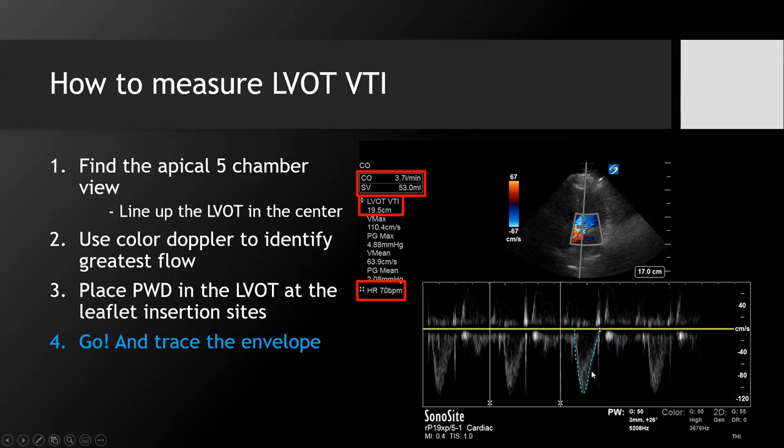You want to get something. This is borderline already. Even this example that I'm giving you is not the most perfectly ideal. It's good enough, I think. But you should be worried if it's extremely fuzzy, or if you're not getting clear demarcation of the borders. Then you're probably just off axis, bad angle, poor measurement, not aligned with the aortic outflow, which should be a clean graph like you're suggesting. Gotcha. Thank you. If you looked at different examples of VTI, this is pretty similar to what I think is pretty standard. But anything more fuzzy than this, I'd be worried about.